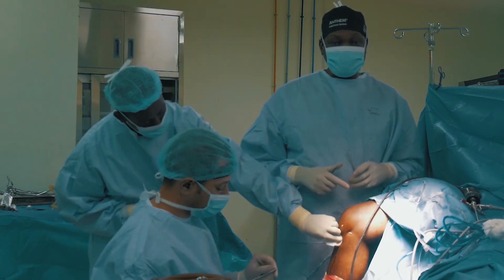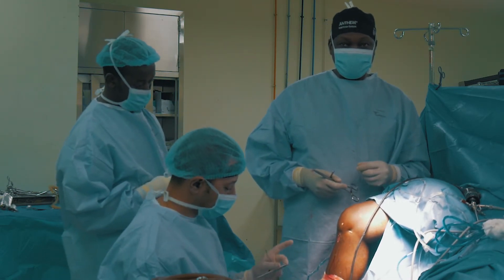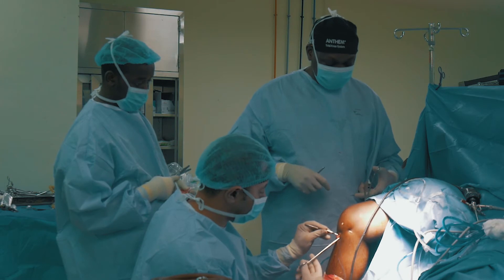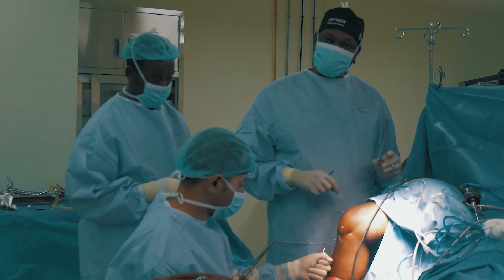We augmented the graft with a fiber tape from Arthrex company, which is a very good construct — basically what you call internal bracing of the structure. It should be firm enough and strong enough that once this patient is fully healed, he will be able to go back to his active life, which is football.